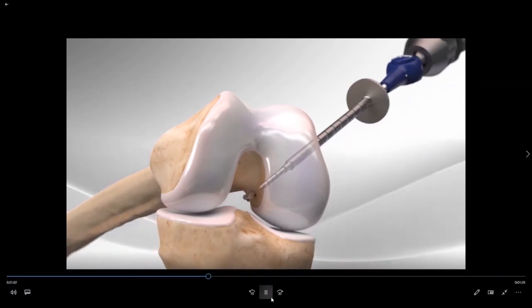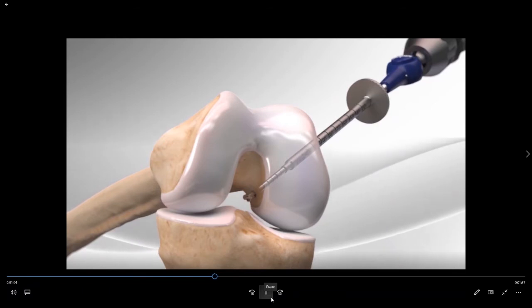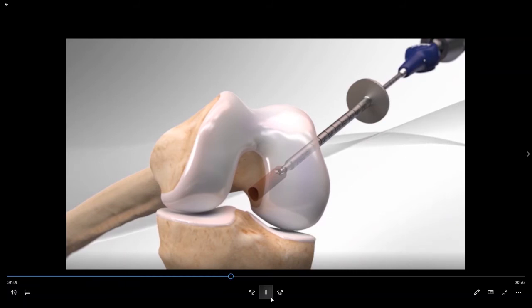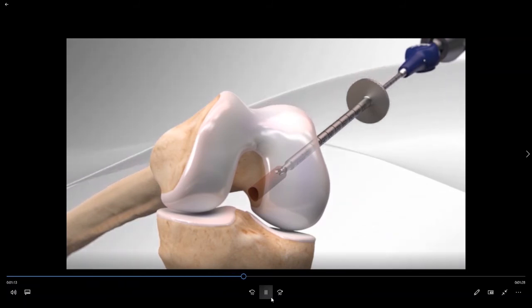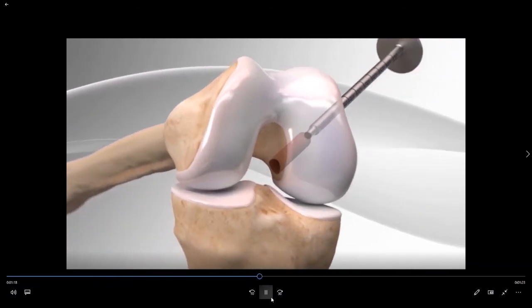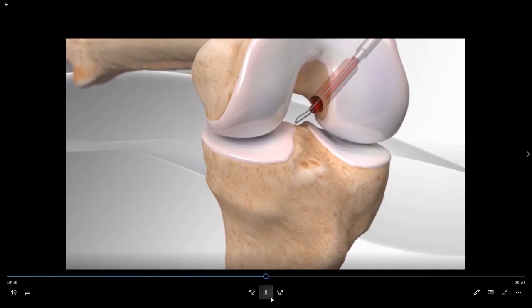The tip of the flip cutter is then flipped and the socket is drilled in a retrograde fashion. We are aiming to have a depth of the socket of at least 25 millimeters to get an adequate amount of tissue into the bone to allow it to heal to the bone.